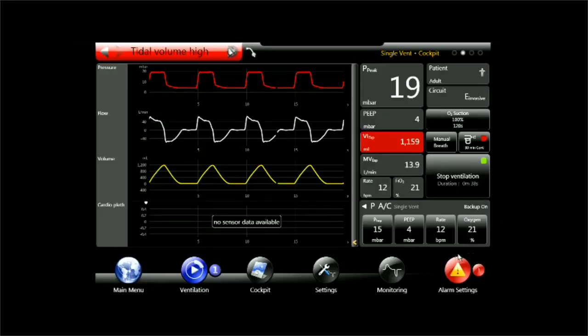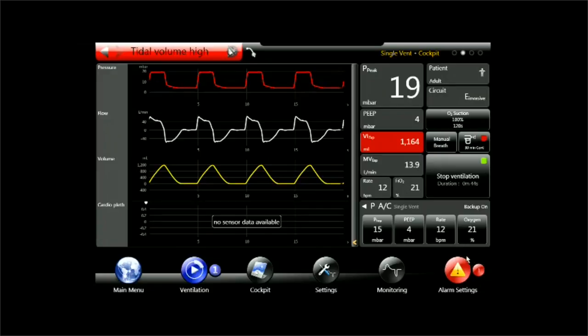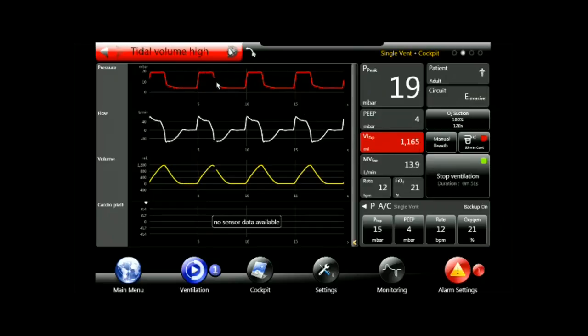I can also see here on the alarm settings icon has become red and is indicating one alarm. I also see that the tidal volume alarm is the one which is kicking. It says tidal volume high and I see that also in the monitoring.